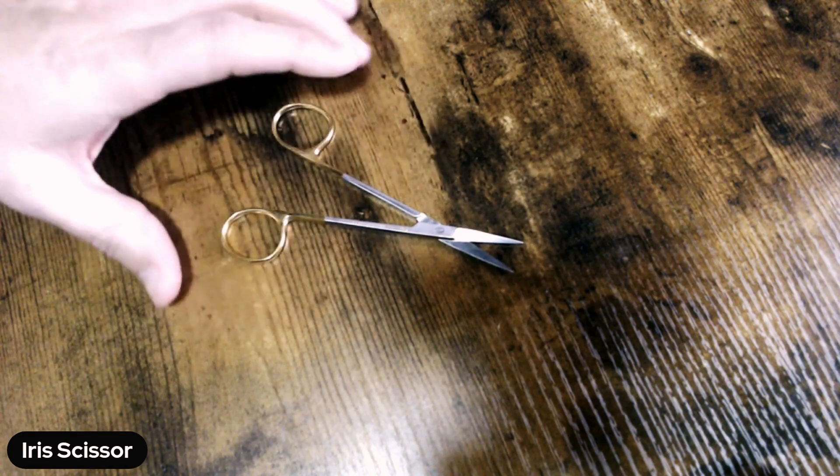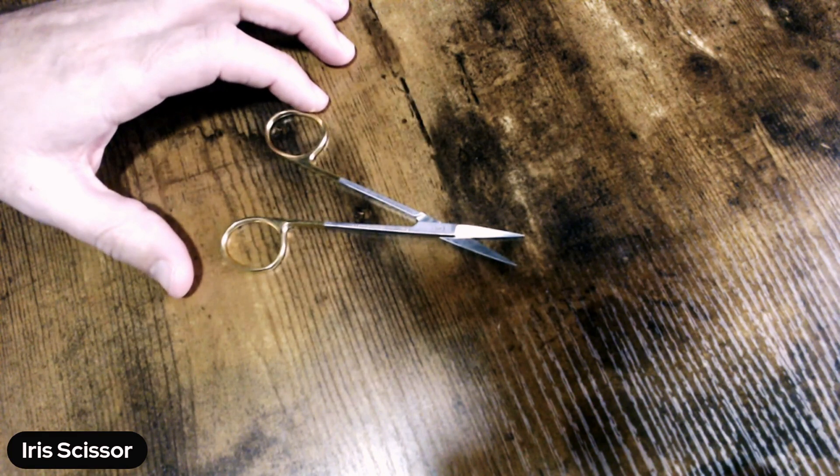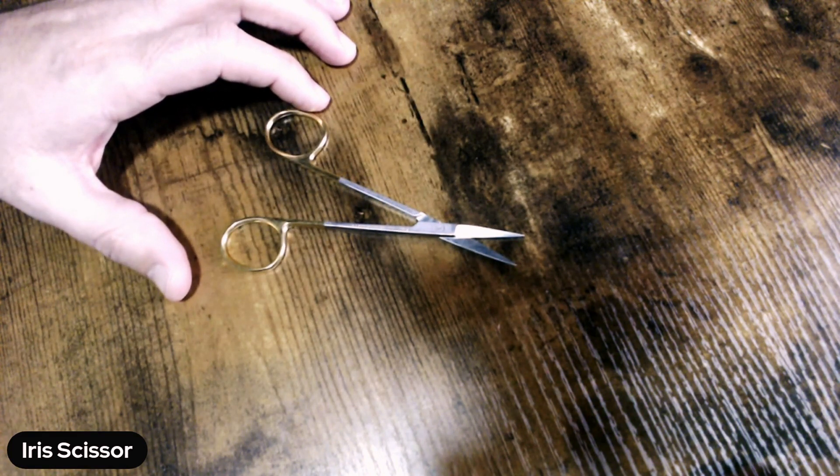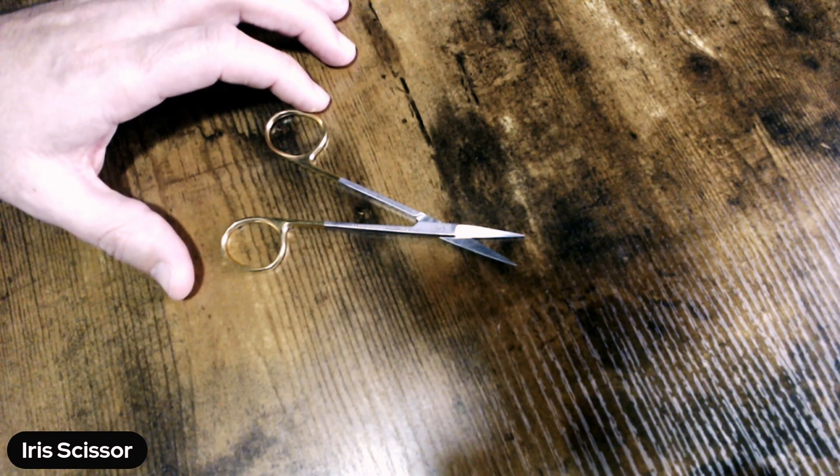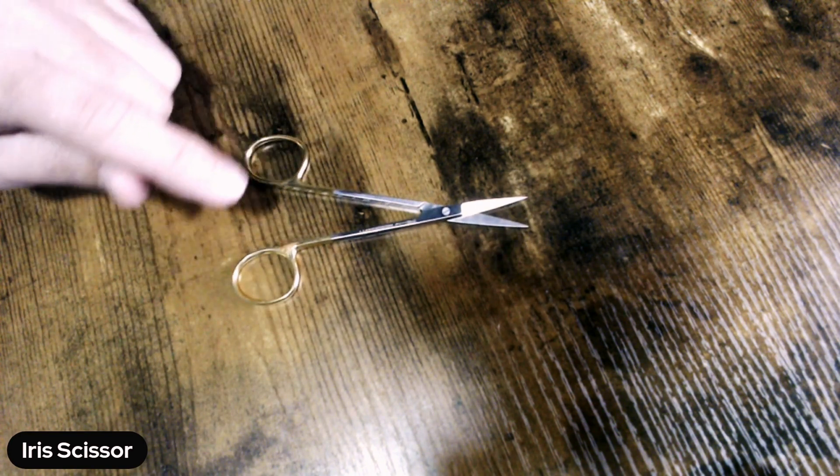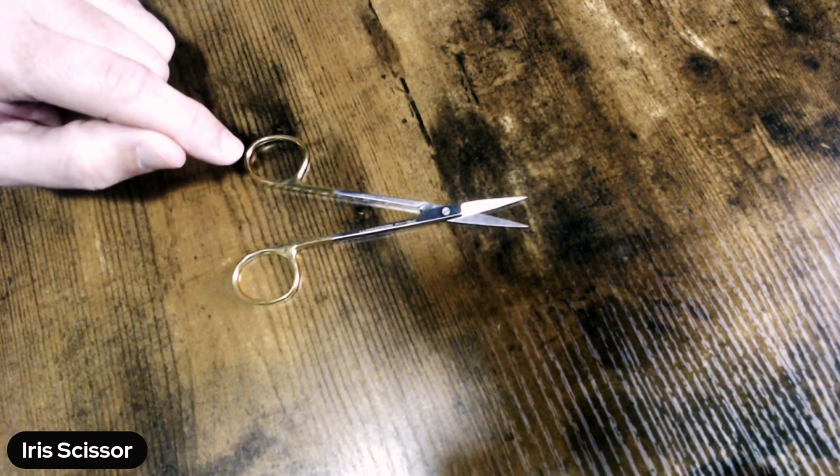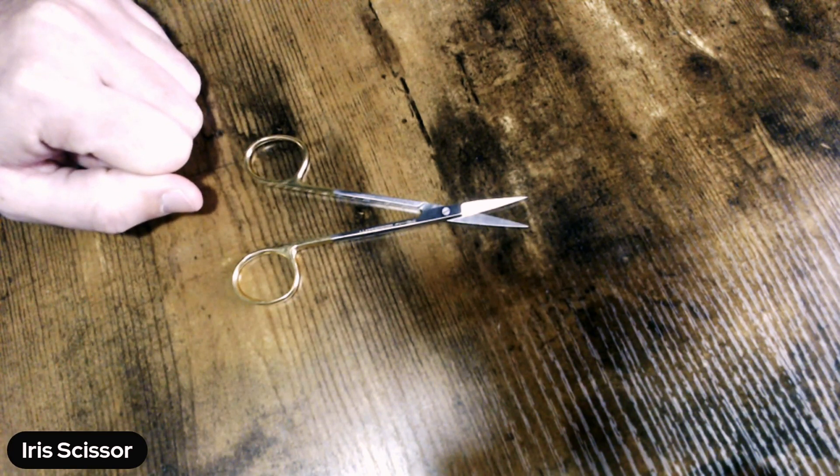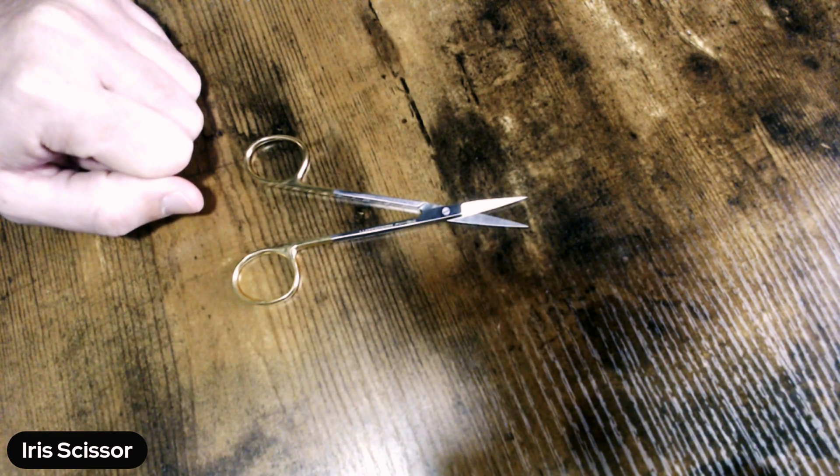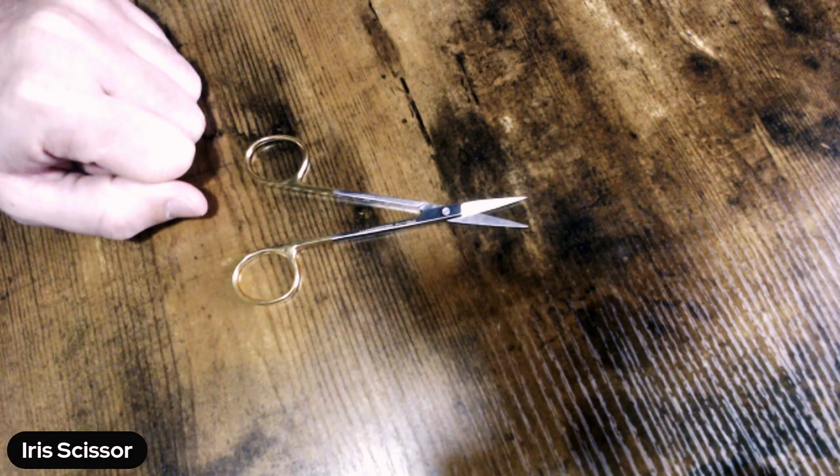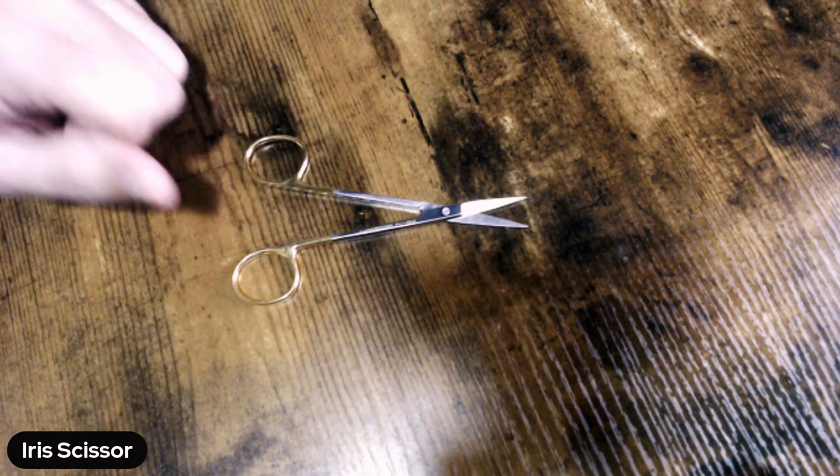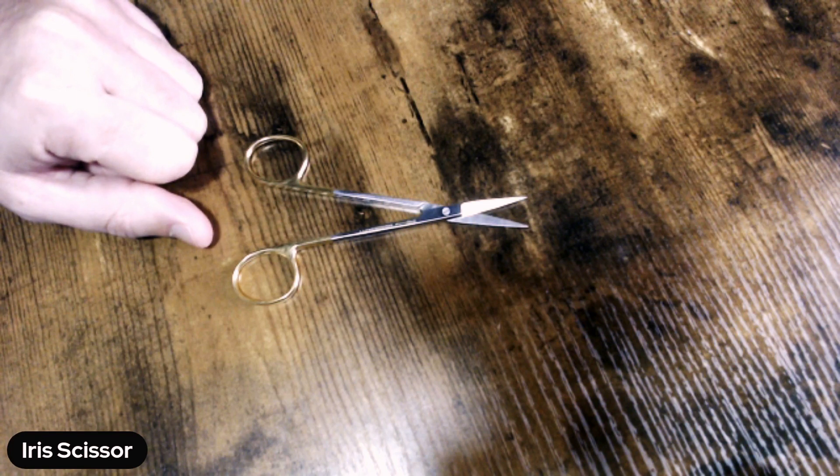Now going back to this tungsten carbide, it's not uncommon in your surgical tray to see devices that have these golden ring handles or some other kind of gold on the proximal end. Often times you see this on your forceps, for instance, or on your pickups. But almost always when you see gold on a surgical instrument, at least on the handle somewhere, that's a tip-off that you're looking at a tungsten carbide instrument.